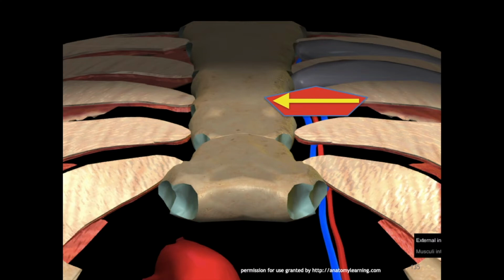Place the ultrasound in the transverse orientation over the plane of interest in order to identify the artery by a longitudinal orientation of the ultrasound.